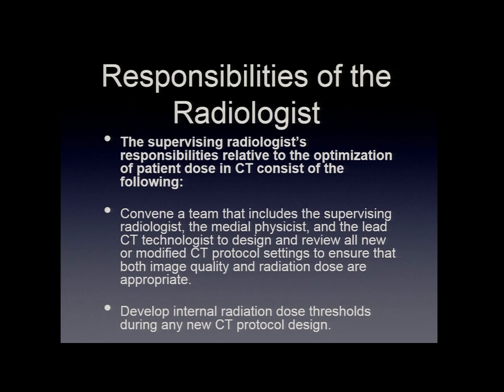And then we also are responsible for working together on this team to establish these thresholds. So if our dose is too high, then we can re-examine the protocol based on a discussion between all of the stakeholders involved in this team.